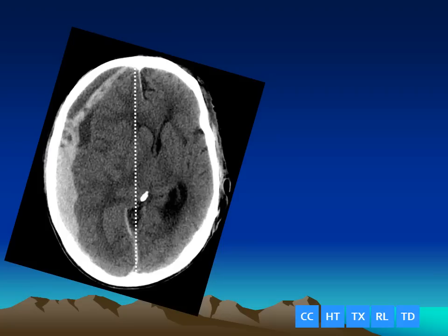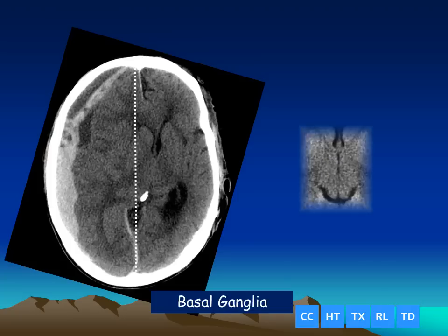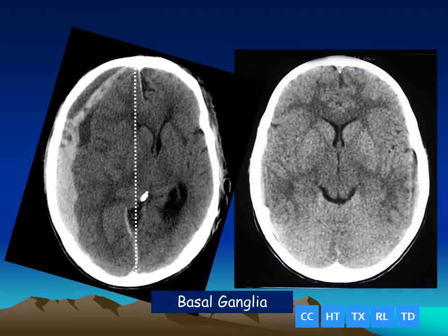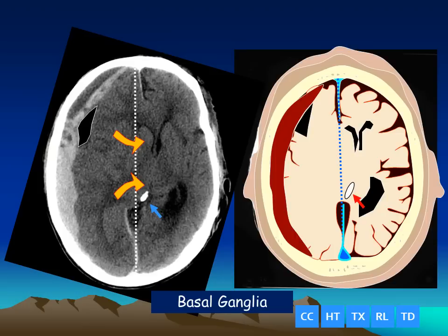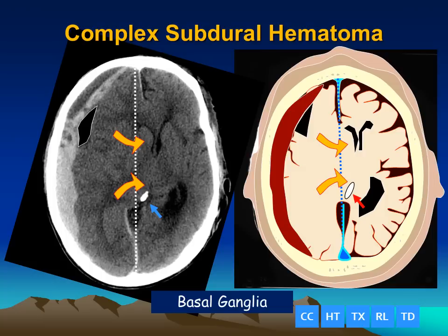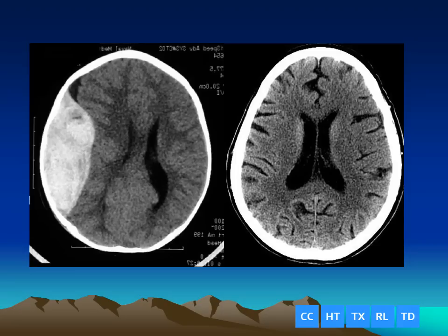Here is another patient that presents with an obvious mass lesion, subfalcial herniation and shift. In comparison to the normal patient at the level of the basal ganglia, we can see that there is displacement of the pineal gland. We can see that there is an extraaxial collection that is outside the subarachnoid space causing subfalcial herniation and shift. This is a patient who had a complex subdural hematoma. Notice that on the abnormal side underlying the extraaxial blood clot, we have compressed the cerebrospinal fluid out of the sulci.